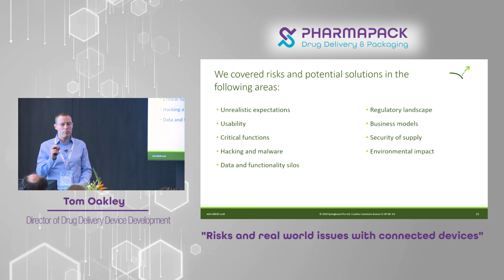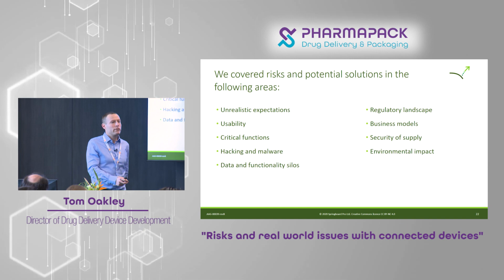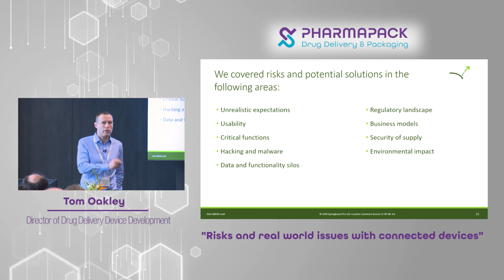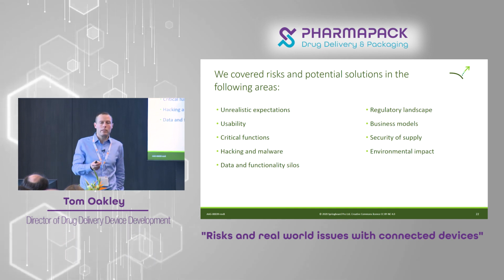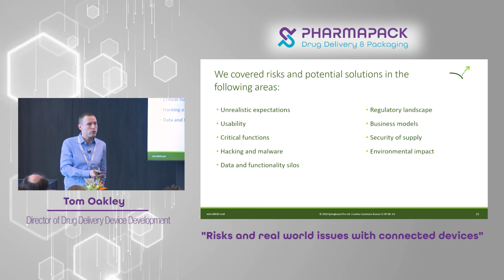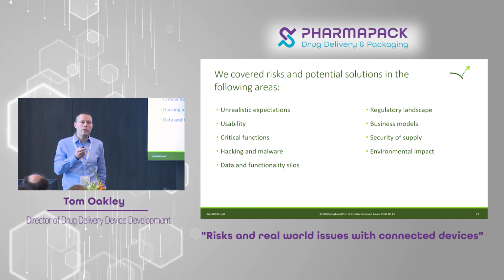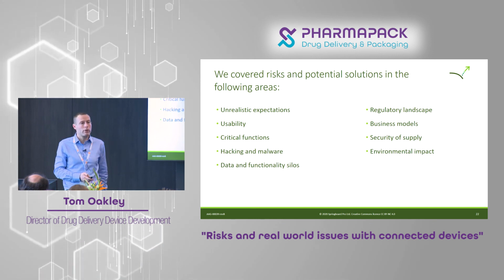And lastly, I'd like to bring you back to that unrealistic expectation. I gave you the example of the lady who had asthma and she had sprayed her cat. If those are the sorts of issues we're dealing with on the adherence side of things, there is, of course, a way of doing this where we can add connectivity which can alert the patient that they're doing things wrong, direct them to training materials, or let the healthcare provider or their clinician know that something's going wrong. If we do that right, then we get patients that are more adherent, more healthy, and better human outcomes.